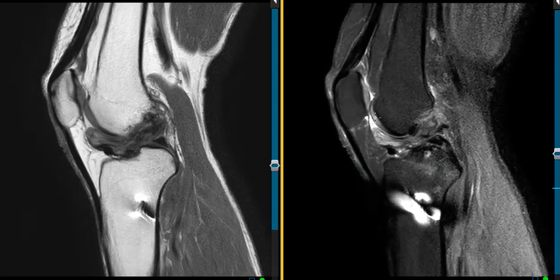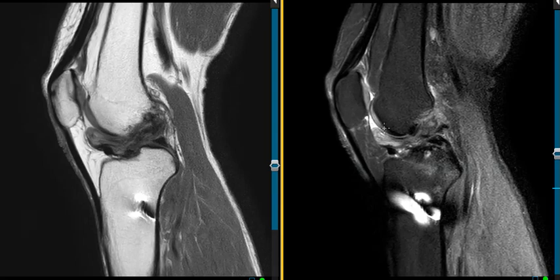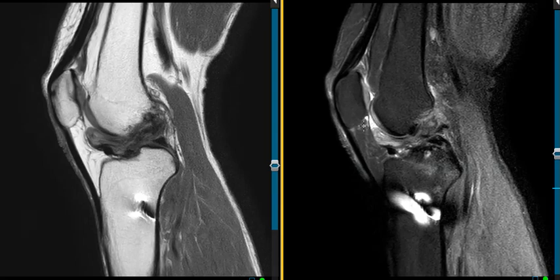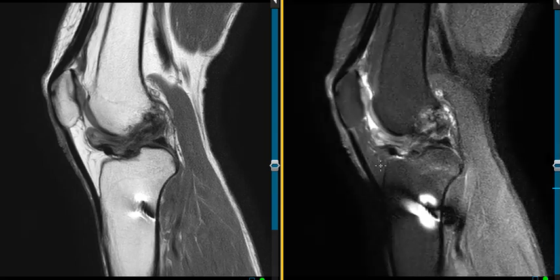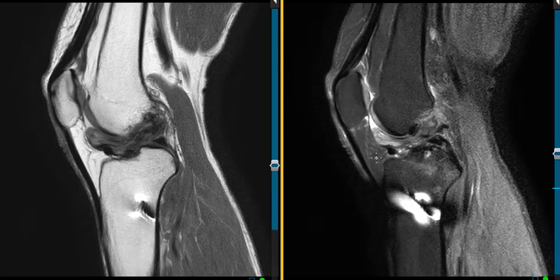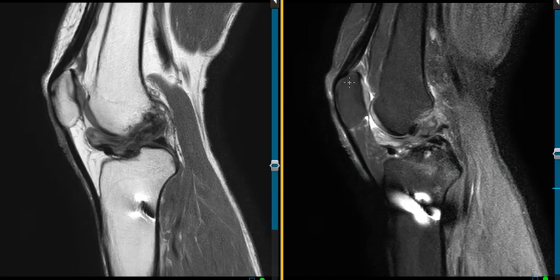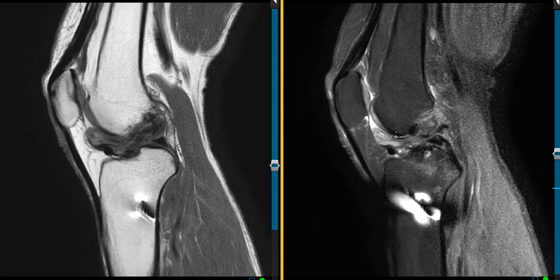This is the cartilage of the anterior femur, a little triangle of fluid collection. And this gray or dark area — this is the infrapatellar fat pad, a little fatty area beneath the kneecap. So the abnormality is this little tongue-like projection here.